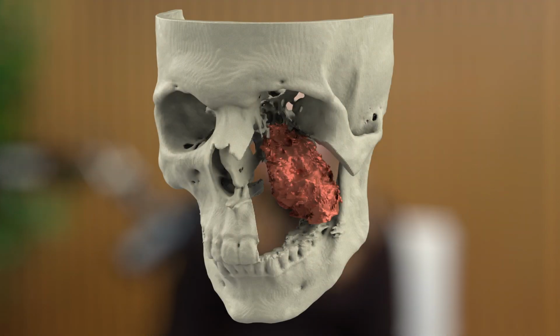Fantastic. Okay, so let's have a little chat about the case and what we were presented with here, with the tumour and so on. If you'd just like to give us an overview, Millie. Yeah, so this was a gentleman who was 40 years old, and he had an ameloblastoma, which is a kind of cancer which originates in the jaw or the upper jaw. For this patient, it was in the upper jaw, so it needed to be removed, and as you can see from the case study, it's rather large.